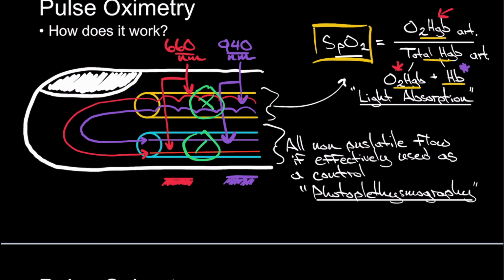And why that's important for pulse oximetry is because when we're talking about pulse oximetry and the percent of oxygenated hemoglobin, we really only care what that is in the arterial system. That's what we're talking about. So when it calculates this, it's able to isolate the pulsating blood in the arterial system and then control for the non-pulsating blood in the venous system. That way you know that your SpO2 percent, maybe that's commonly like 95%, is the percent of oxygenated blood in your arterial system.